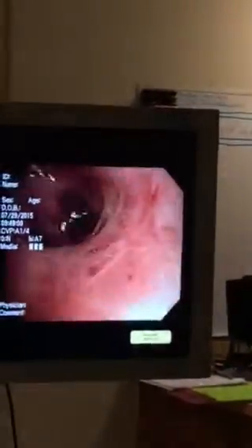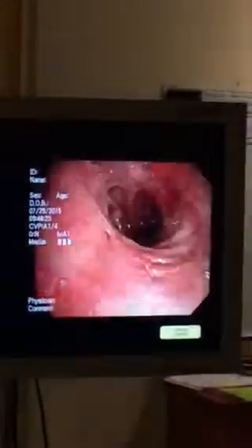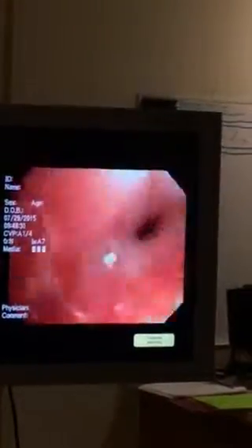But you see how raw those airways are. This is what bothers her. If you try to cough that stuff up, it just gets caught in all these little traps. You see all that? Imagine if you were trying to walk across a field and you had to walk across all those holes and ridges, it would take you forever. It's the same with the mucus trying to come out. It gets caught, and she can cough until she's blue in the face and still can't get it all out. Alright, more saline now.